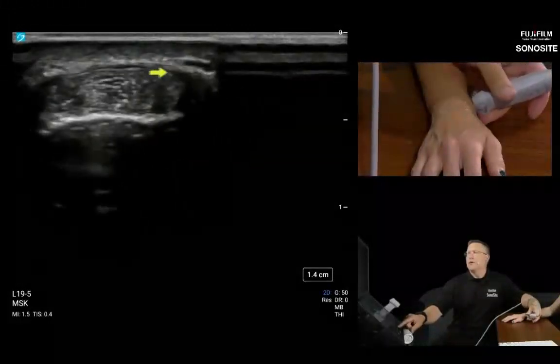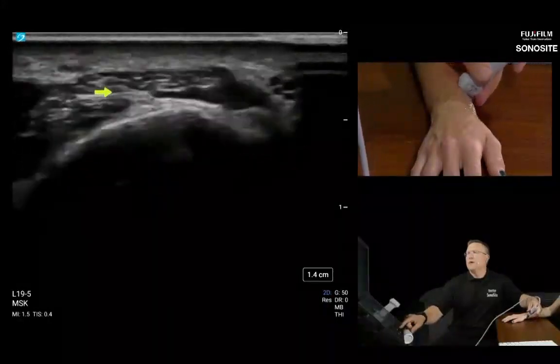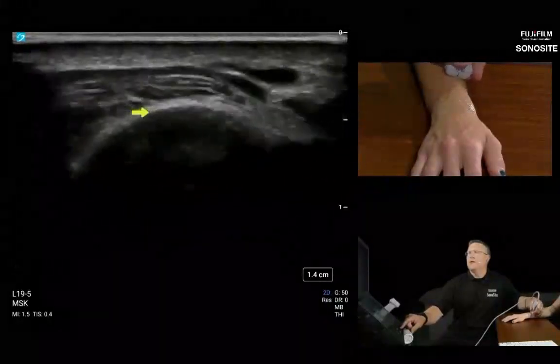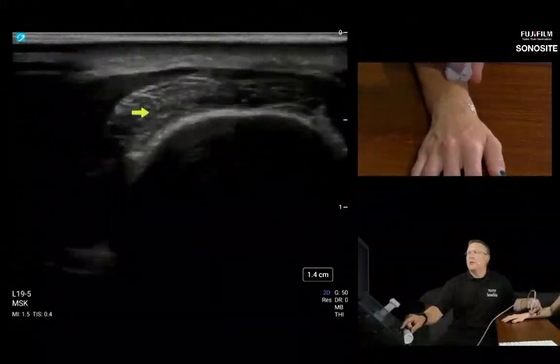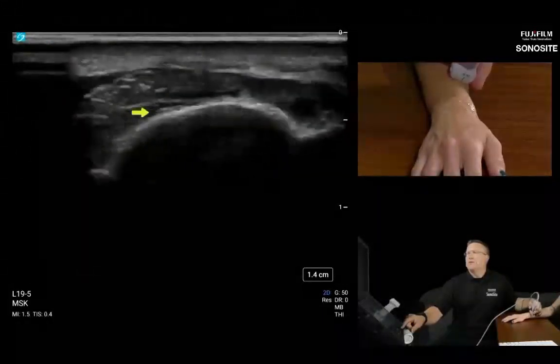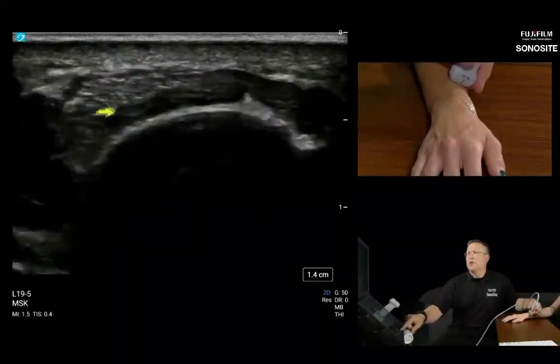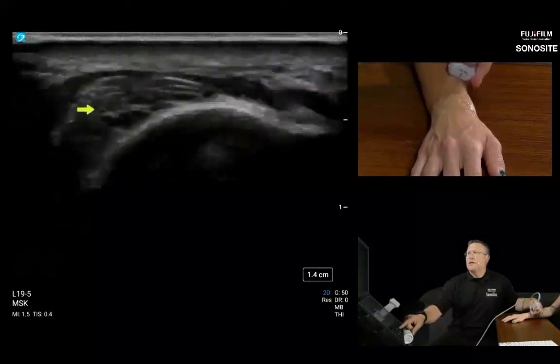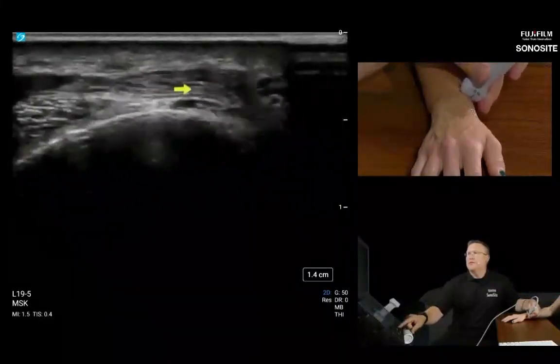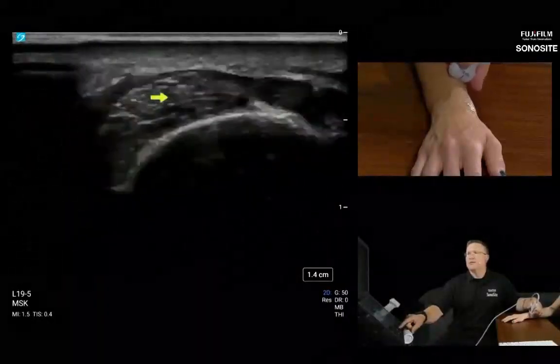So here's APL again. Follow this oval, and here comes ECRB and ECRL underneath. Right there, that grinding area where you see those two areas literally intersect over each other. So here's compartment 2 underneath, and here's compartment 1, mostly APL, and they can grind on each other, and that is the intersection syndrome of the wrist. So proximal to those retinaculum, I'm looking for intersection syndrome.